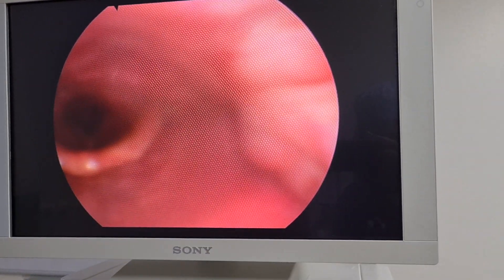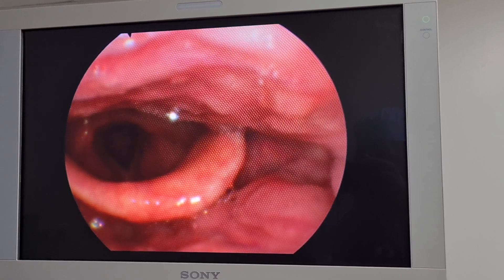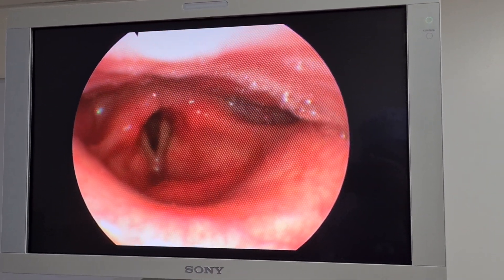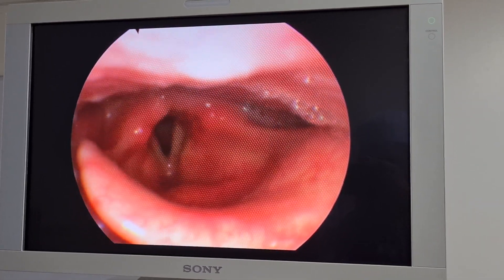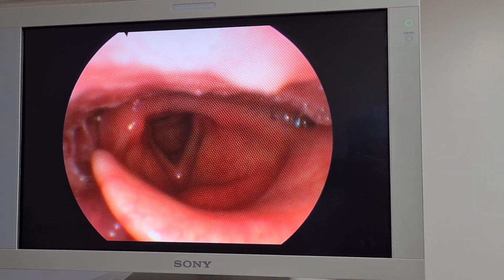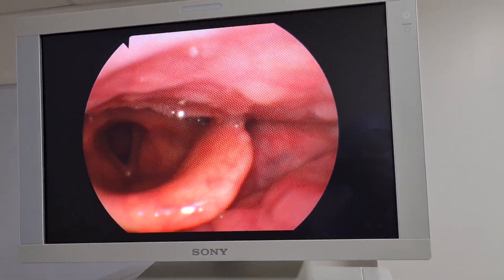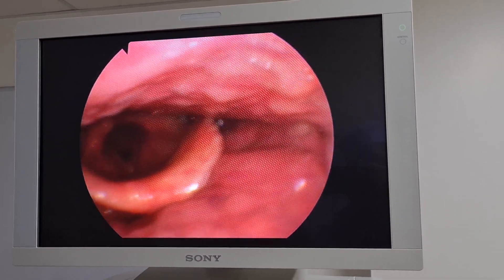When you assess someone's larynx — the supraglottis, glottis, and subglottis — you're interested in two things: function, which we just tested, and anatomy. You look at the structures to see whether you can see any abnormal features. On either side of those white bands, which are the true vocal cords, you've got the false cords. We usually look for abnormal growth and abnormal changes. Vocal cord nodules are usually present at the anterior two-thirds. Things like infection can cause pus around this area. You'd also be looking if the cords are not moving, and whether there's a tumour in the way.